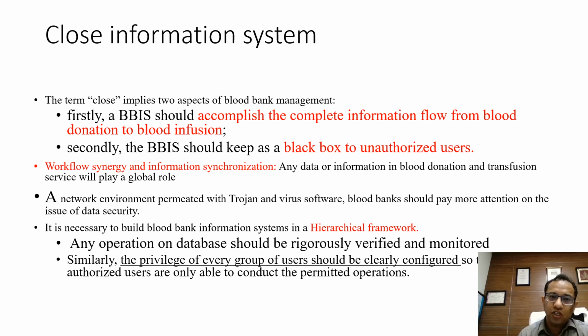The workflow synergy and information synchronization should happen, and any data or information in the blood bank transfusion service will play a global role. So whatever you're putting in is going to have an impact. So you should have a workflow synergy. Also, you should keep in mind that the network environment is permeated by some viruses and software. So we should pay more attention to the issue of data security as well.